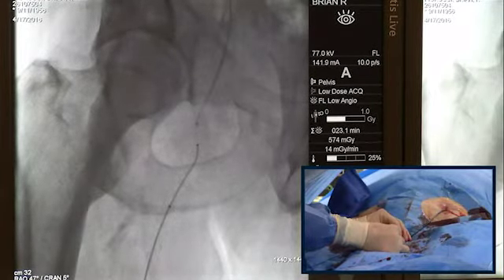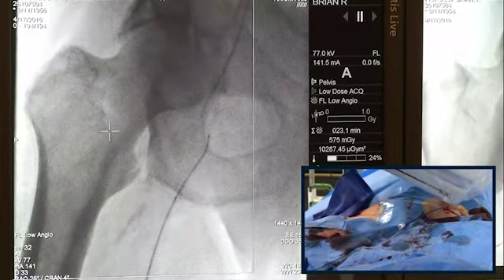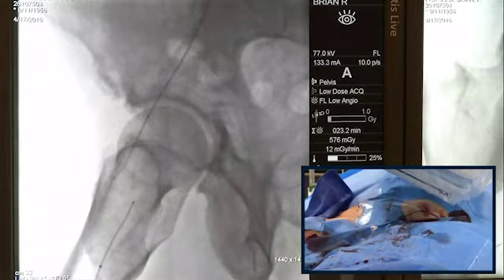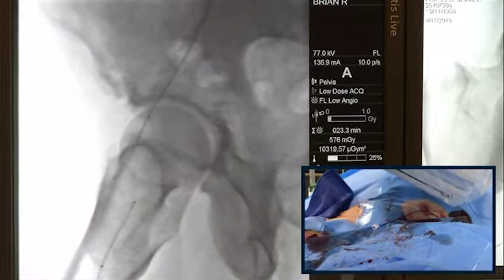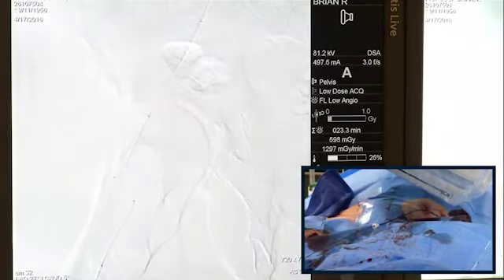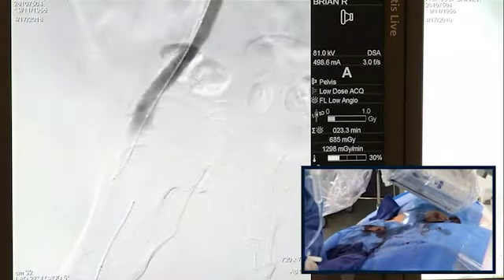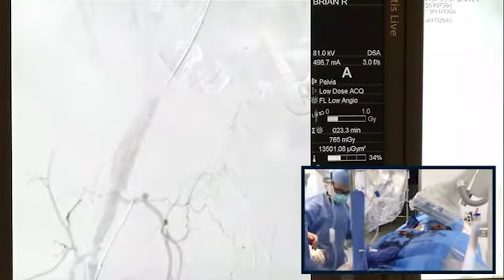Okay, let's do another picture here. One second. Let's go to the contralateral view. And you come on this side. Well, you should go into a right oblique view here, because otherwise you will not see. So it's interesting. Yeah. Here we are far away. Okay, try not to move. Okay, so that's interesting. So that's good actually.